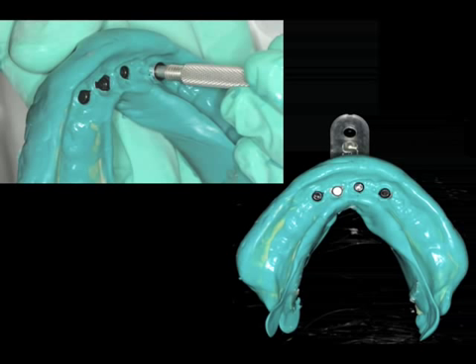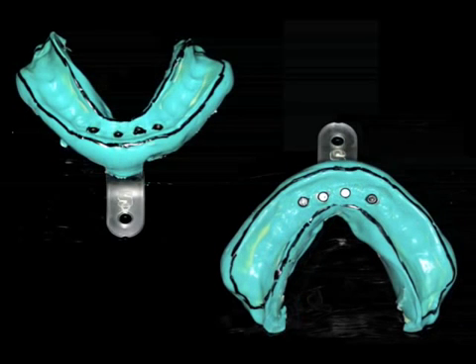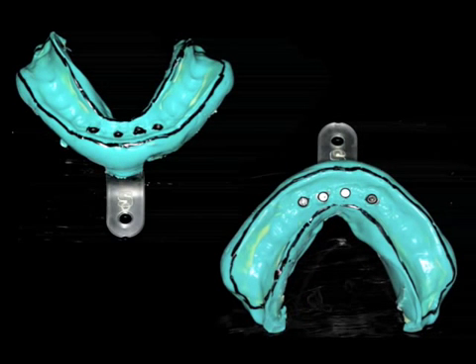And when we have 7 or 8 implants, many times we don't always need the entire sulcus. But in any case, whenever you're doing an overdenture, it is primary that we always get the vestibular borders and a nice integrity of the entire ridge. Here's another view, and in this case I've actually taken a little inking pen and I'm now showing you the outline of the entire vestibular border.